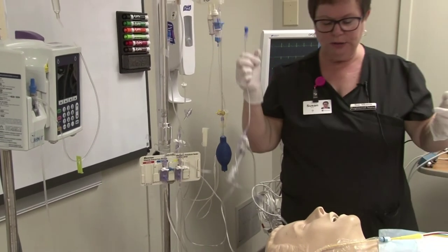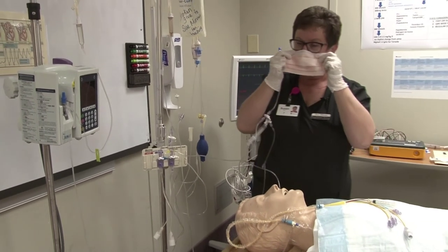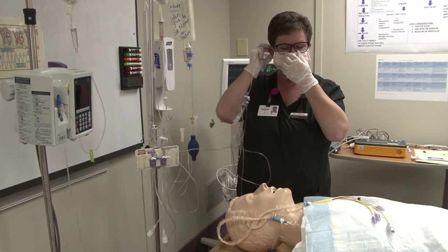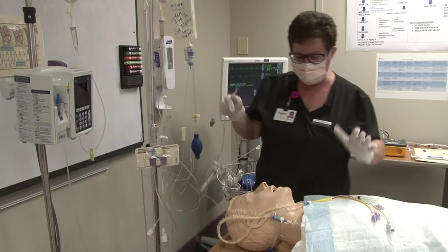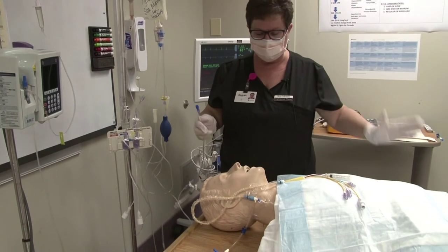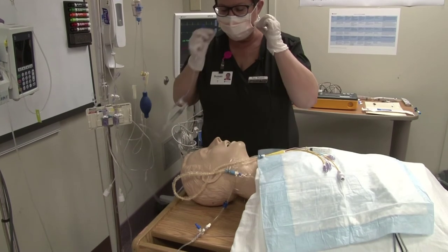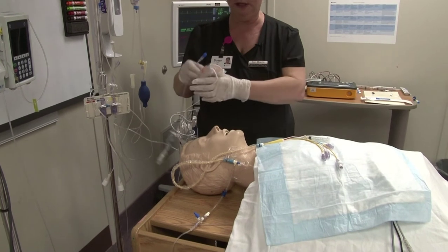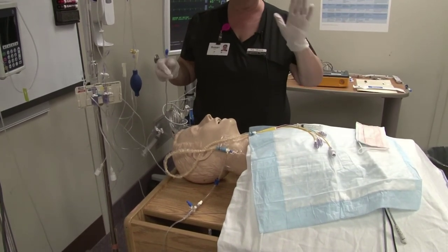When my patient arrives, I'm going to put on a sterile mask because I have to disconnect this catheter from its source. The very first thing I do is check and make sure I have the right patient — I do an assessment of his armband. Remember, you should have a sterile mask on for this portion of the setup.